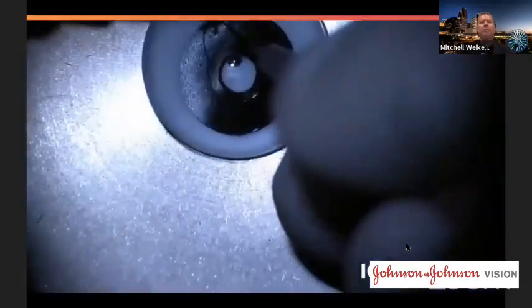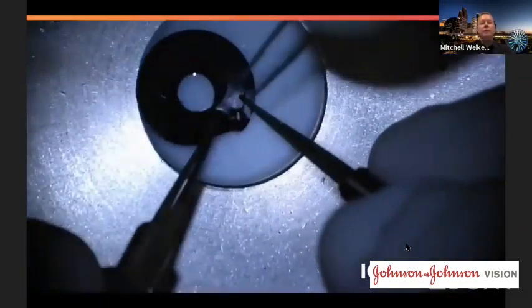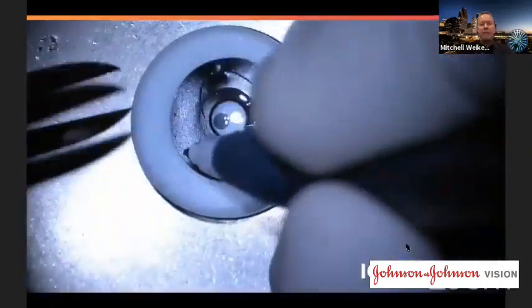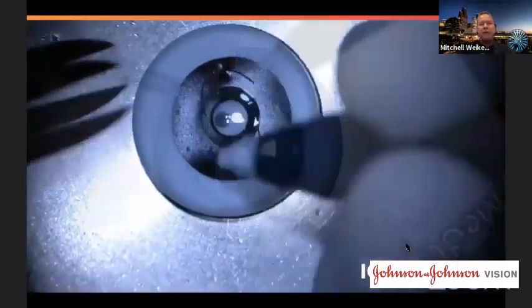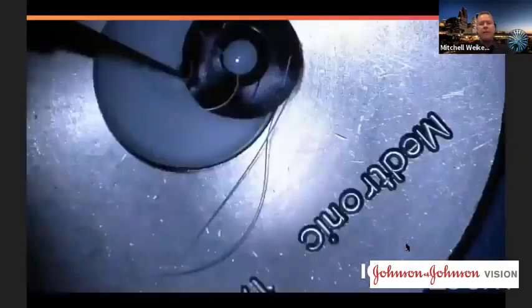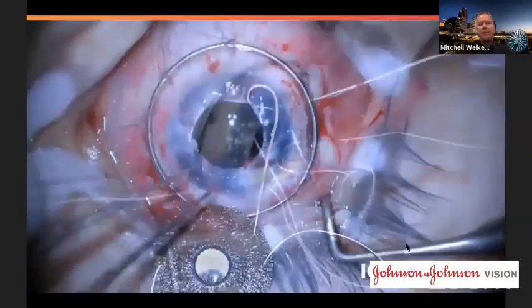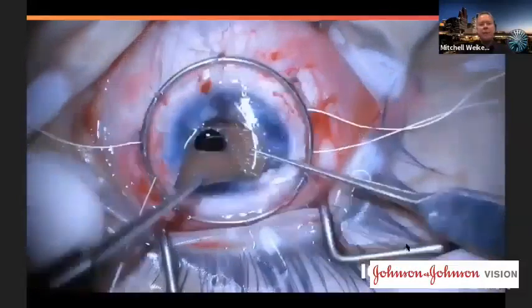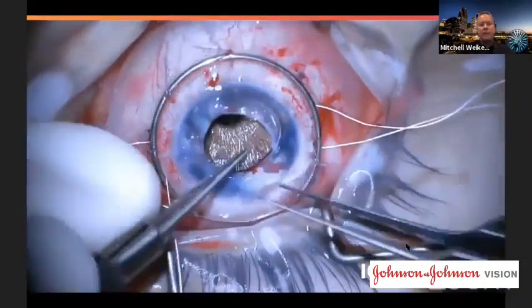Here I did belt loops where I made the incisions perpendicular to the edge of the implant. You can see we've tucked the haptics through those little belt loops there. And now I'm going to go 90 degrees and make my marks to pass my Gore-Tex suture, again, about a millimeter from the edge of the iris prosthesis. Since it's open sky, this is actually pretty easy. We're just going in through four paracenteses we've made here, and we're going to insert the combination of the IOL.